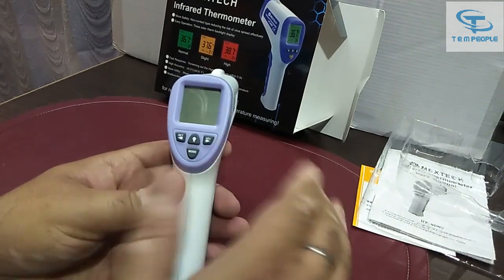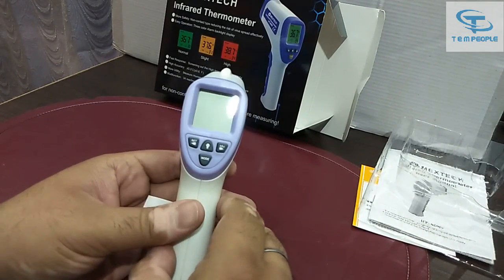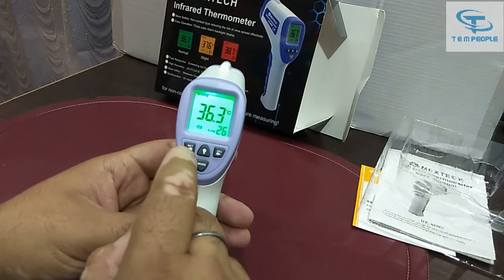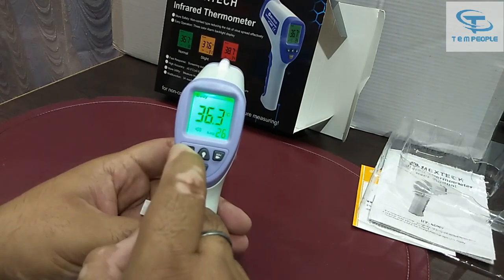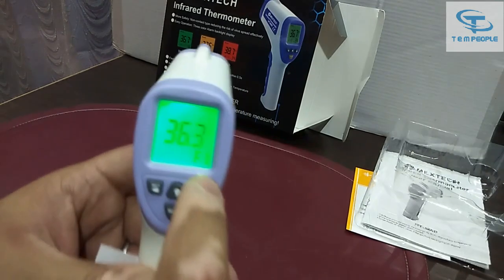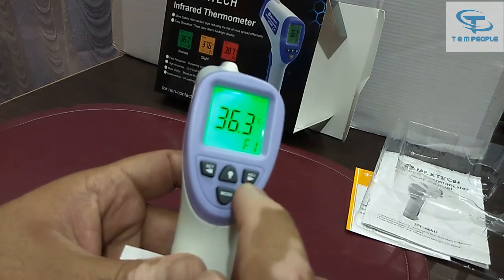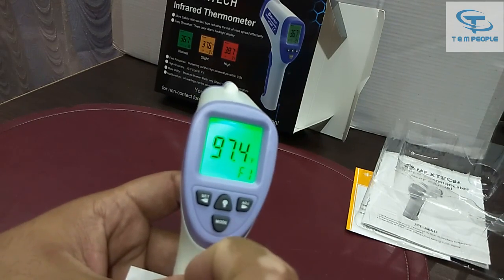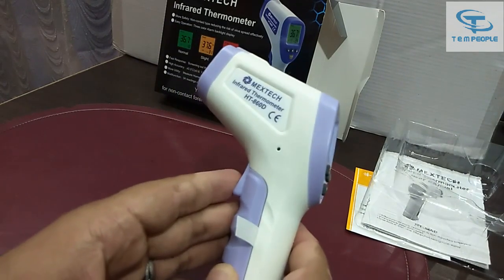To change from degrees Celsius to Fahrenheit, turn on the meter and press the Set button for around one second. You'll see F1 glow on the display. Then press the ADJ button, and you can see it has switched to Fahrenheit. Then click the main switch again to confirm.